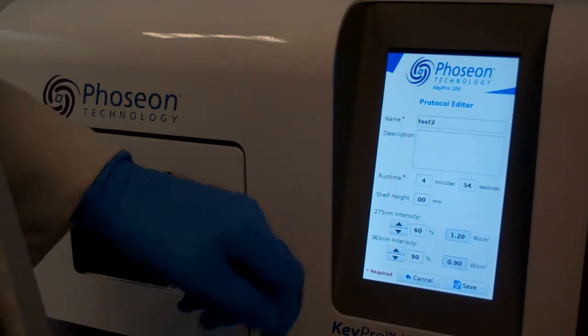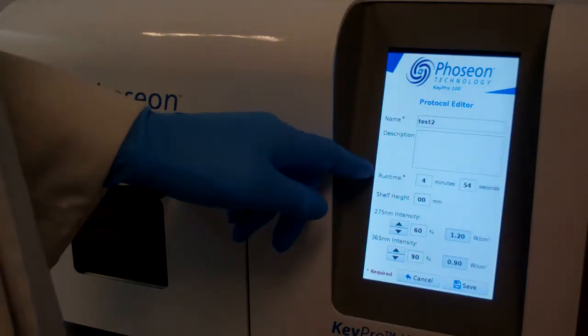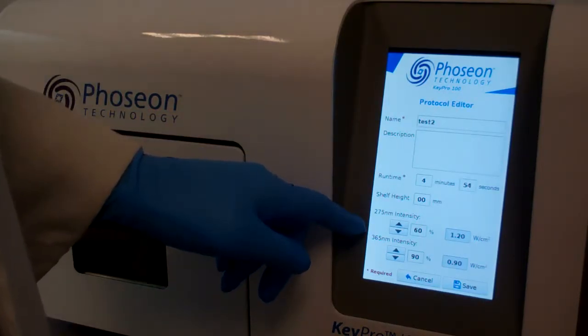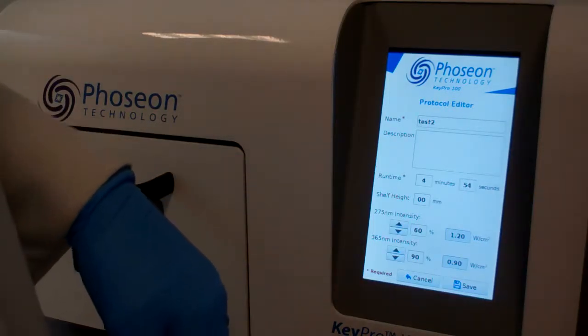Once the name, time, and at least one intensity level is programmed, then the protocol can be saved by touching the Save button.